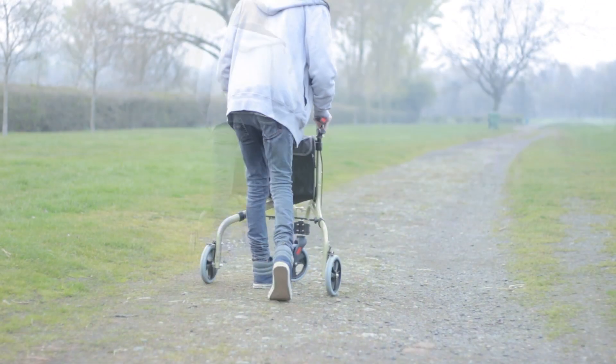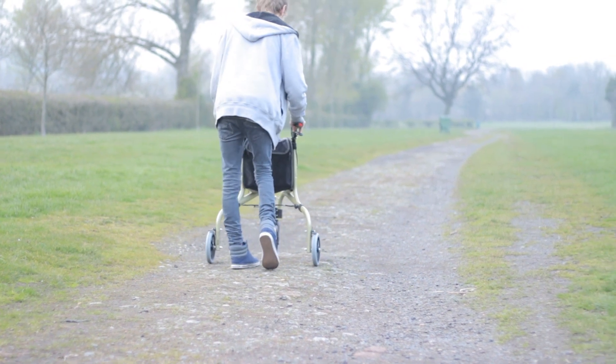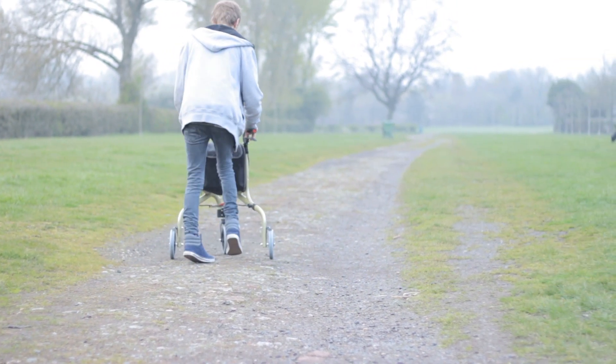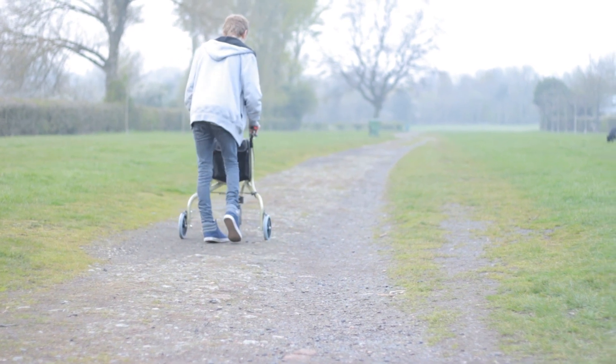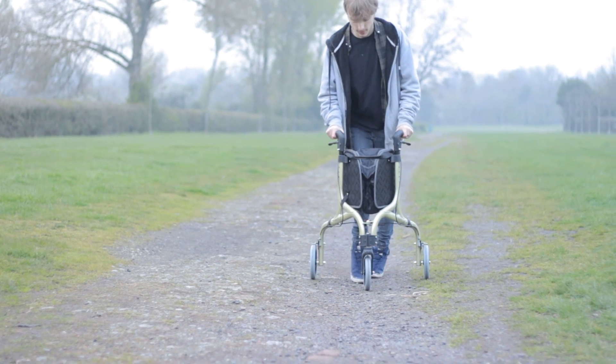I have tried this product over various different surfaces. Outside it moves freely over grass and tarmac. The lightweight frame allows it to turn easily, and by applying one brake it turns automatically as you push.